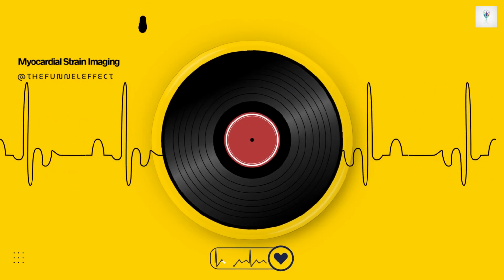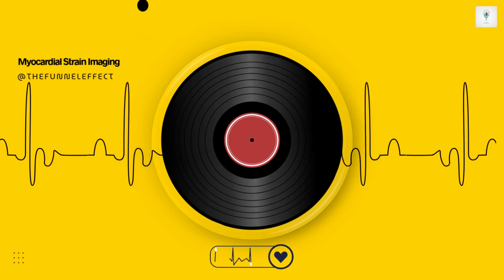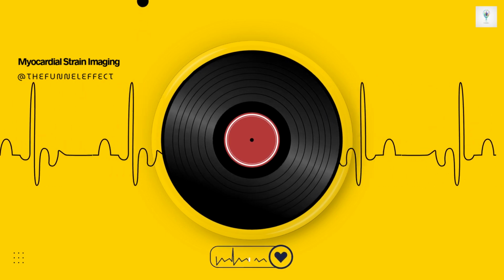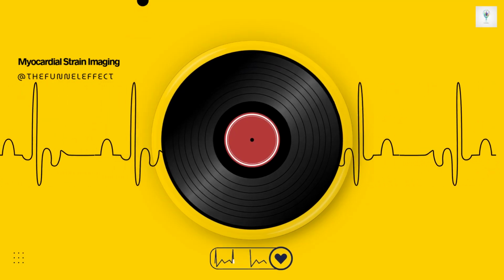Okay, let's get into the language of mechanics here. When we talk about strain, it's a concept borrowed from engineering, isn't it? Where did it start, and why is it the right term for heart deformation? You're exactly right. Strain comes straight out of continuum mechanics, the science of how materials deform under stress. It describes the change in shape of any structure. Like a bridge beam or... Or, in our case, the heart muscle.